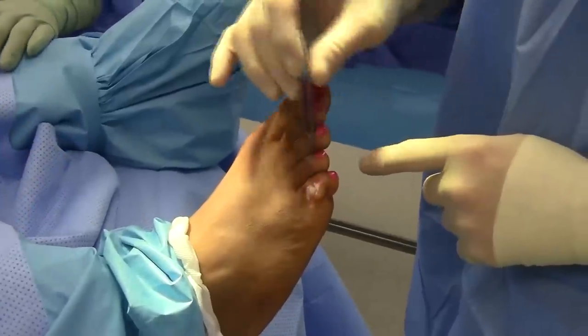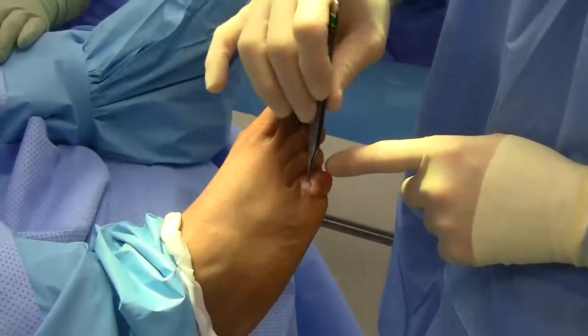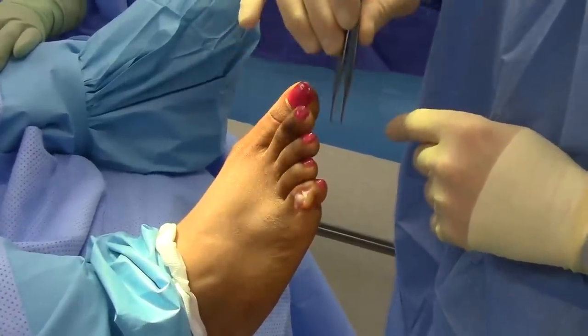Proximal phalanx exposed — this is the deformity. The level of deformity is right at the proximal phalangeal joint, which is prominent right at the edge of the bone right here.